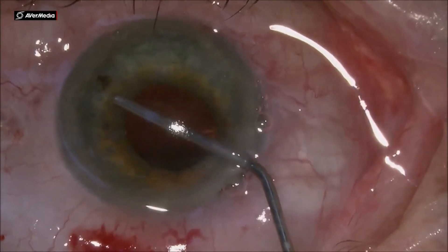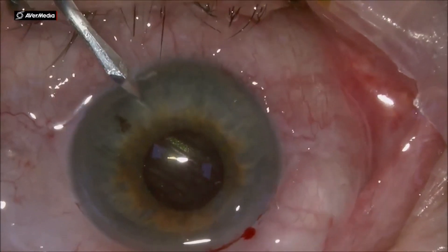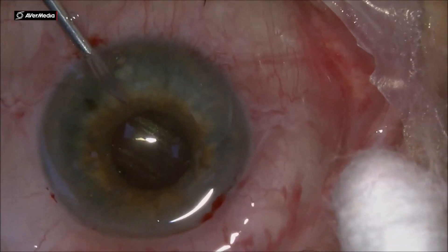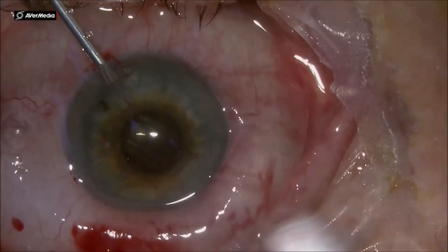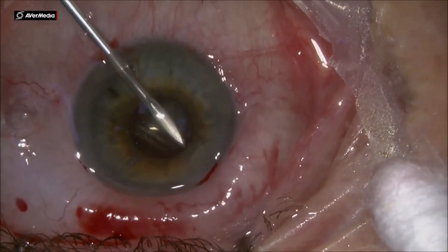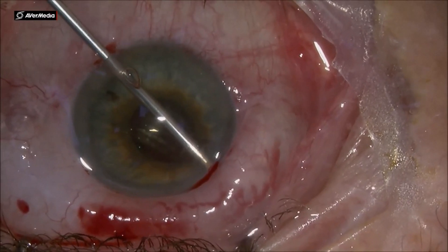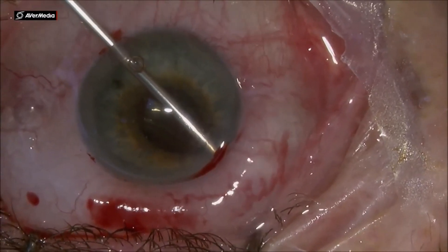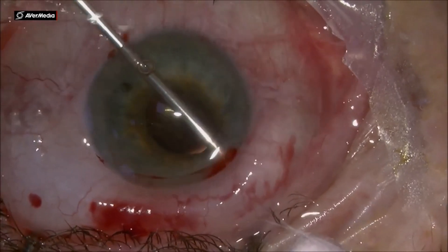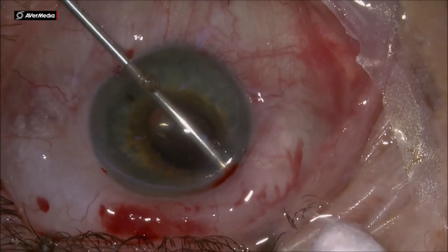Dear colleagues, this is a new mixed procedure that I came up with. Basically, at the end of the phaco surgery, we go across the cornea from the lower temporal quadrant to the nasal upper quadrant, where we know that more than 60% of the collector channels are located. And we do a sclerectomy — an ab-internal sclerectomy using a needle.